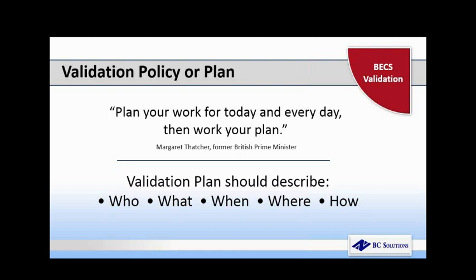But what you consider major changes, and other times that you might want to do validation, need to be determined by each facility itself. So you have the ability to decide what those terms mean to you.